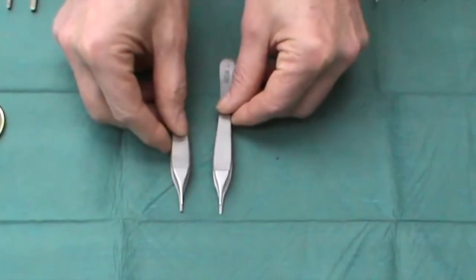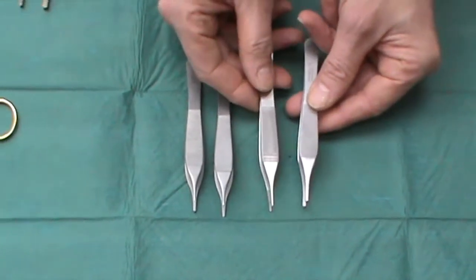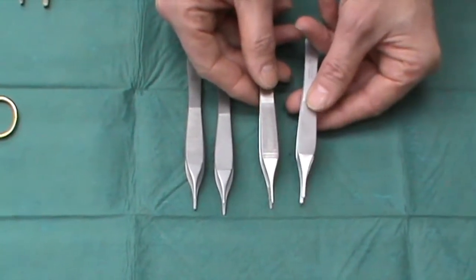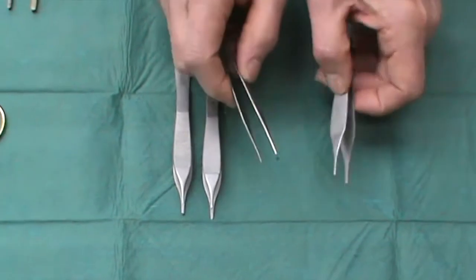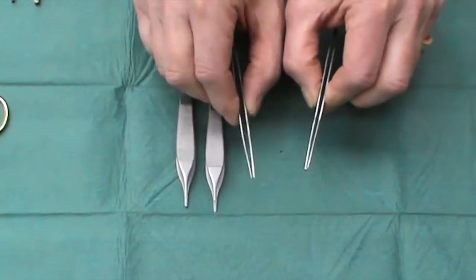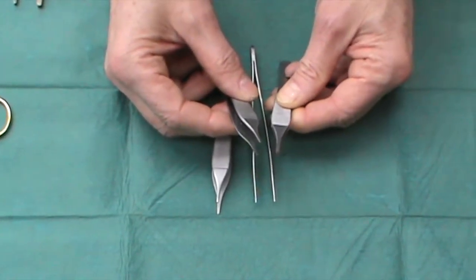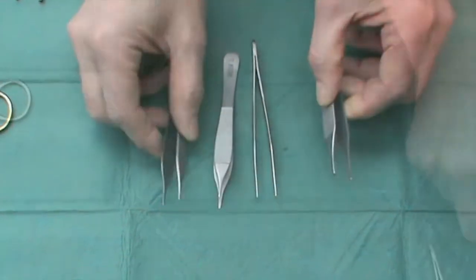These are perfect. A copy of these in a single-use disposable set looks very similar from the outside, but the action is nothing like as delicate, and you'll also notice that the teeth are not as fine on the toothed ones.